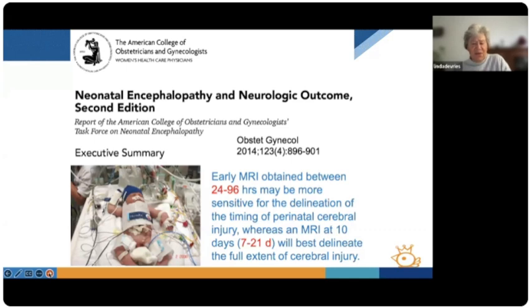So in fact, it's a little bit too early. And also the baby needs to be removed from the NICU to the MR scanner in the middle of hypothermia. So we really would not like to do this. Now, if you do it beyond the first week, then you lose your diffusion, which is really something that you would like to look at, because it's so easy.